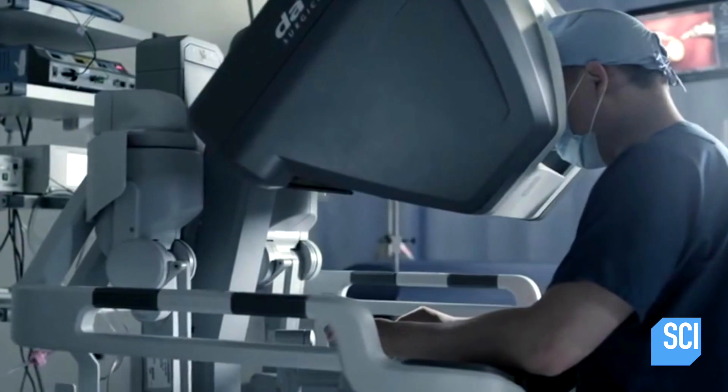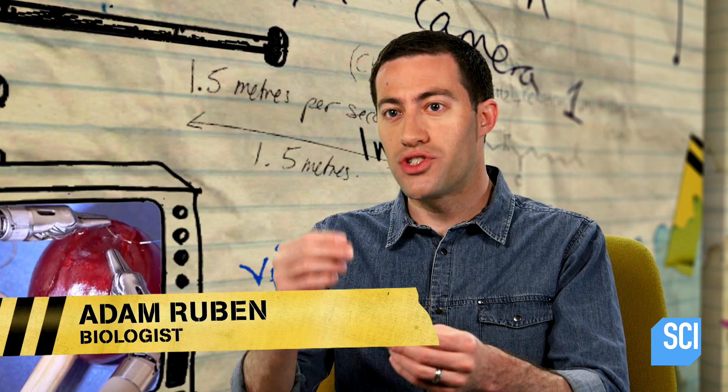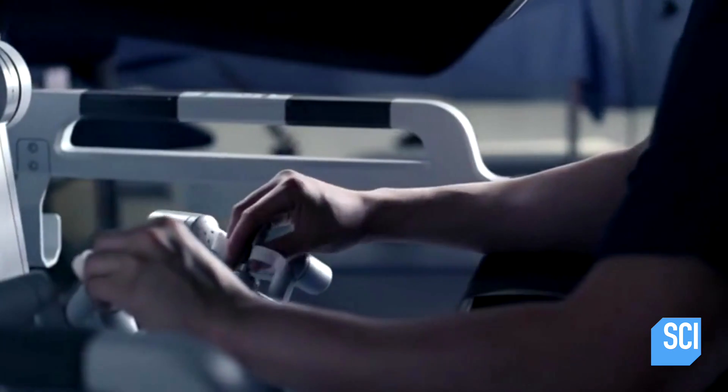So the surgeon is actually sitting behind a console where he can see what's going on on a high-definition screen. The doctor can even zoom in up to ten times on that grape skin, and the instruments themselves can rotate with seven degrees of motion.